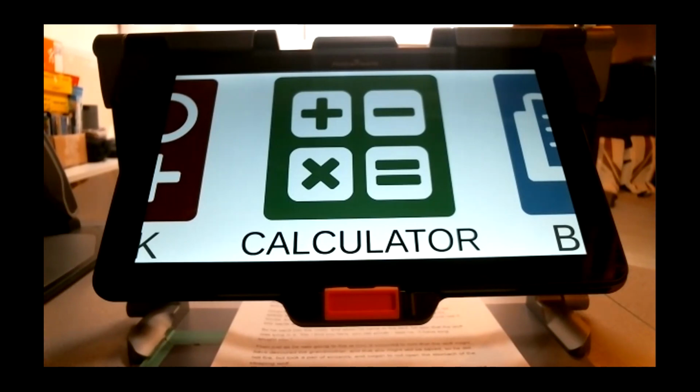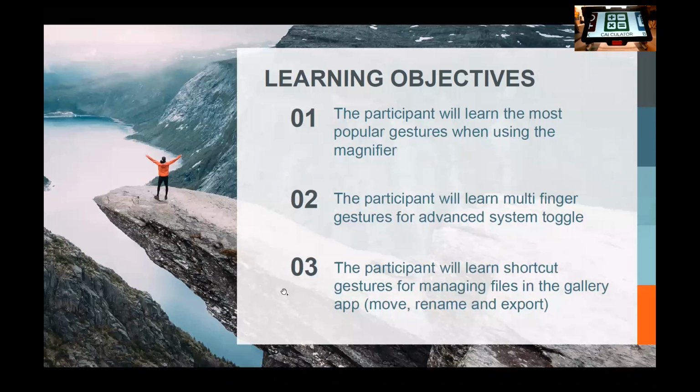So now let's review a bit our objectives and see if we've accomplished them, and do a little summary. I know that when I was in school, I loved it when my teacher did a summary with the class so that we could see what we'd learned and if we'd learned it. So I'm just going to switch to my screen and back to my objectives. So, my 3 learning objectives. What did we do today?